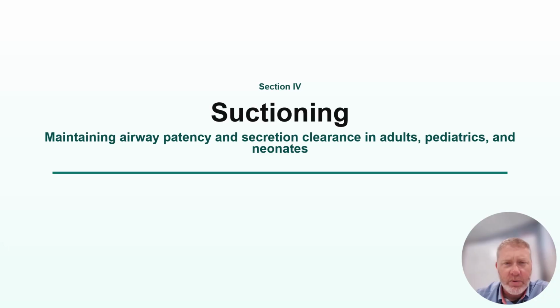Suctioning. Before we get into suctioning, let me go back quick for non-invasive ventilation. There's a sheet that's in Canvas. Take a look at that. It's my little 2 or 3 page cheat sheet for all things non-invasive ventilation. But take a look at that for normal settings. Typically, the IPAP or the top number is like 10 to 20. Typically, your EPAP is 5 to 10, so it's 10 to 20 over 5 to 10.